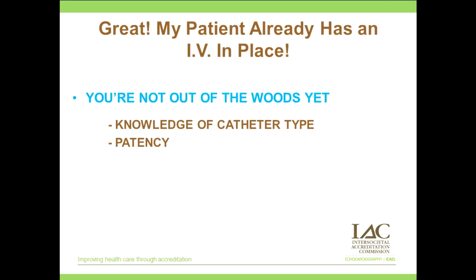So I was scanning this patient in the echo lab. Things were going really, really good. Of course, I didn't determine at the beginning of the study if I needed contrast. Why should I? I thought she already has an IV in place. Okay, so I moved on to her apicals and immediately knew that contrast was in the picture. I thought, no problem, my patient already has an IV in place. You know where this is going, right?